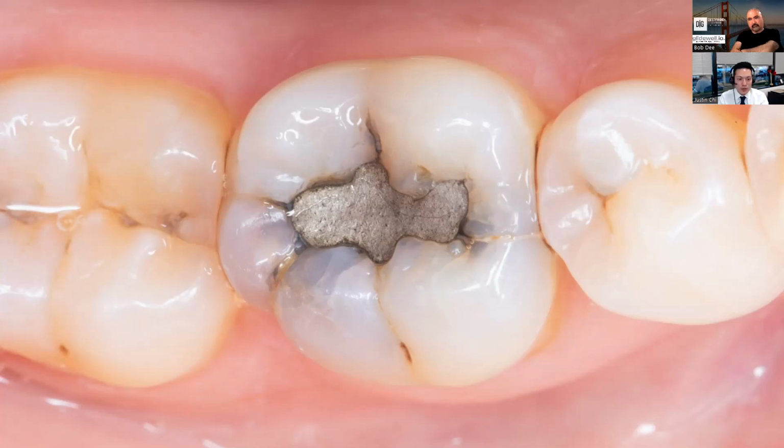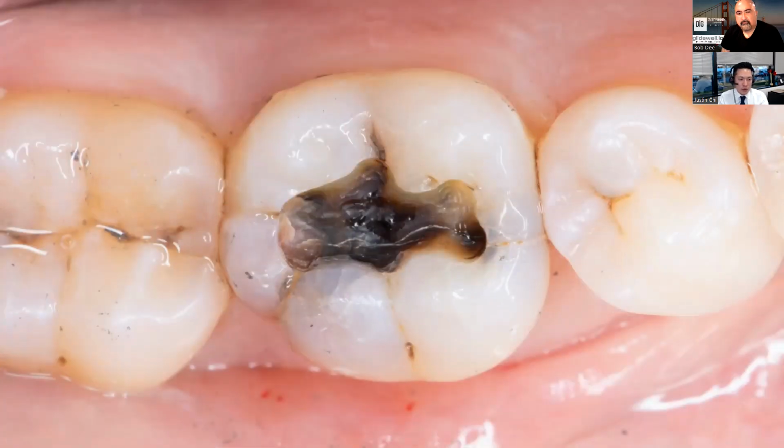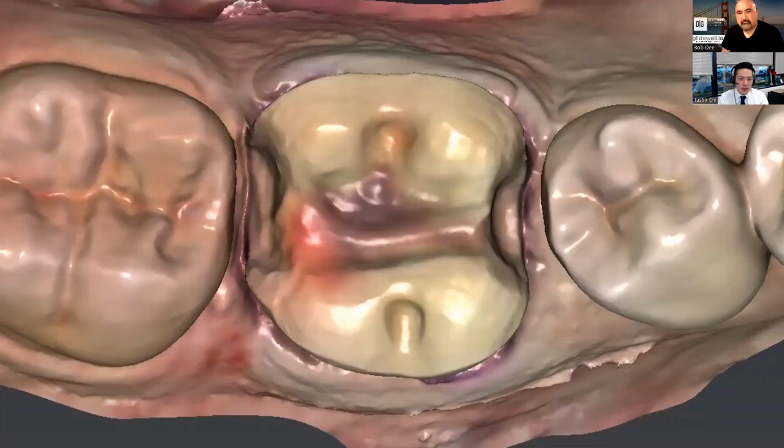Let me show you another one here. This is a cracked tooth syndrome patient. No pressure sensitivity. Take off the old amalgam. You can see that fracture mesial to distal. For these cases, as long as the tooth is still relatively stable, of course, not moving in multiple pieces, I'm going to do a full coverage. I do a full coverage, kind of like an overlay, crown lay. You know, we hear different terms. I like just overlay. But to the software, we just call it a crown.